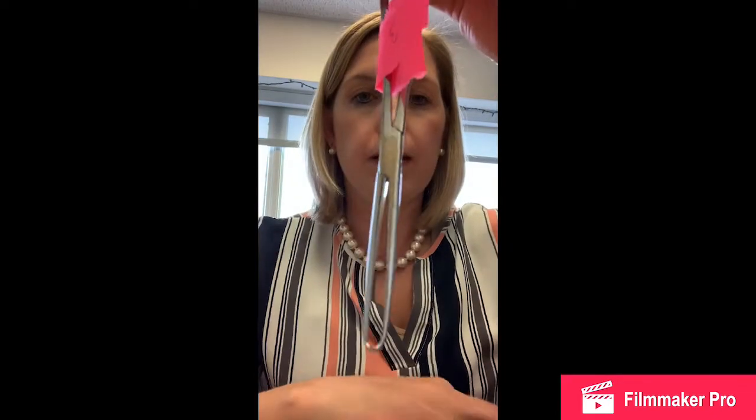It's used to hold bowel. The most common time that I use it in my practice as a colorectal surgeon is to reach through an ostomy site and to pull that bowel up through. Generally, think of it again as a fairly gentle instrument when I'm just trying to hold bowel in and out of places. Contrast that with the Allis clamp here.